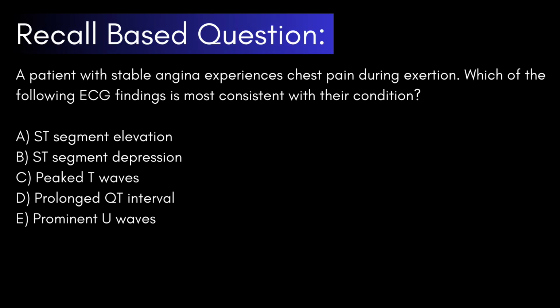A patient with stable angina experiences chest pain during exertion. Which of the following ECG findings is most consistent with their condition?